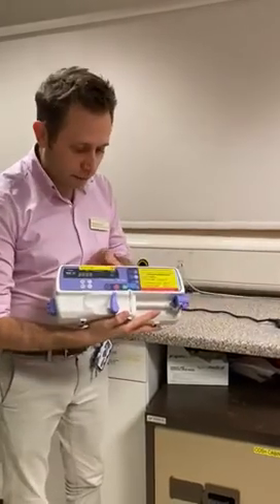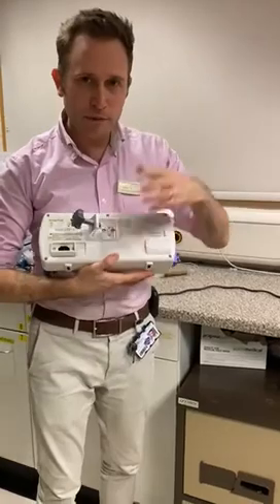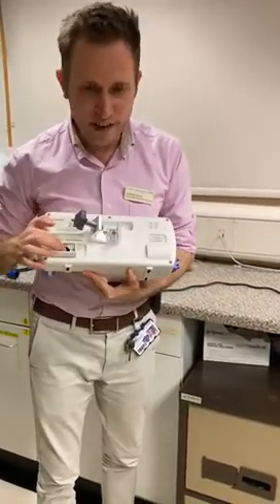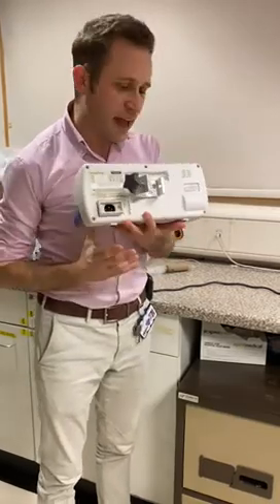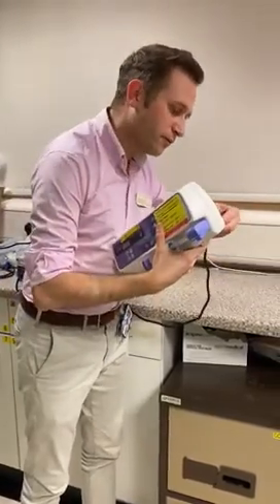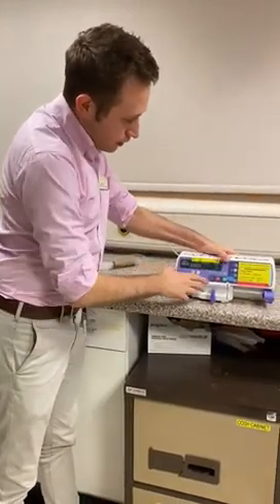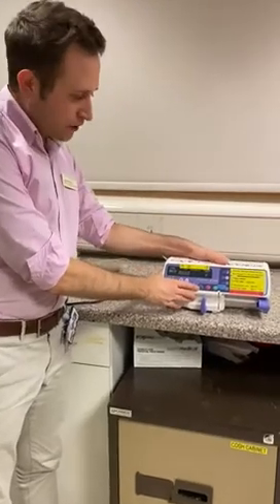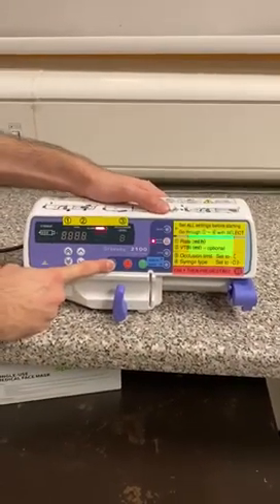Let me show you around the pump. We have a display, and around the back we've got a pole clamp — really simple — and we've got where we attach our power. This doesn't fit into any of our normal docks, which means every pump is going to need a power lead. So we're going to plug that in now and turn it on. Here is the on button — it's not obvious, and you have to hold it for quite a long time to turn the pump on.